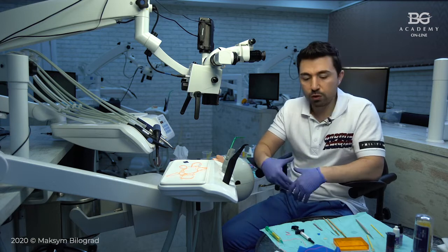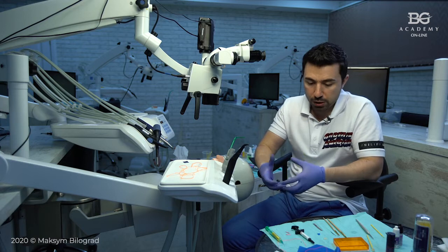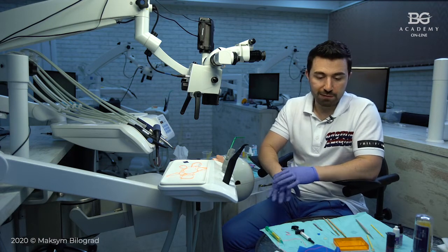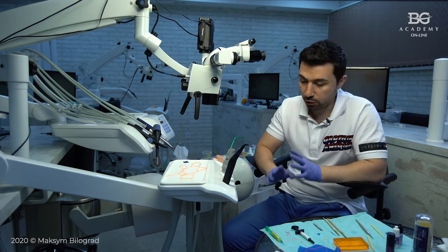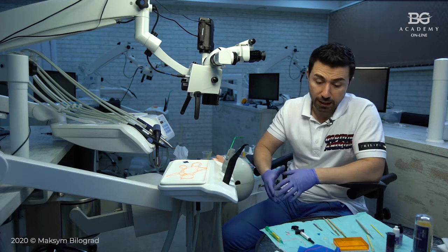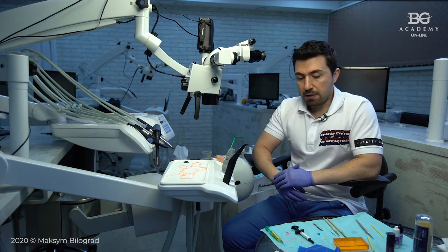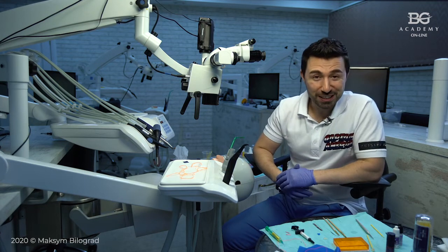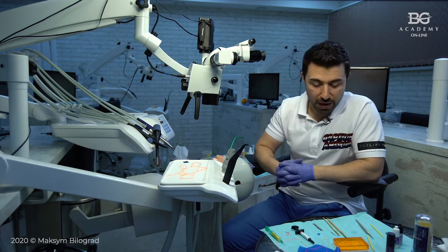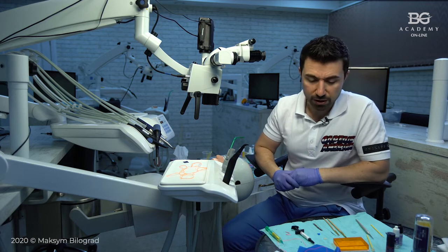So from my opinion, rubber dam is one of the most important steps to complete the bonding protocol. I'm not trying to say that without rubber dam you cannot bond veneers. You can, because I know a lot of people that are not using rubber dam for cementing veneers, and they have pretty good and successful cases. I cannot do this. Once you know how to work with rubber dam, you will love to work with rubber dam, because it is really ergonomic and you can control the process of treatment in a really fast way.